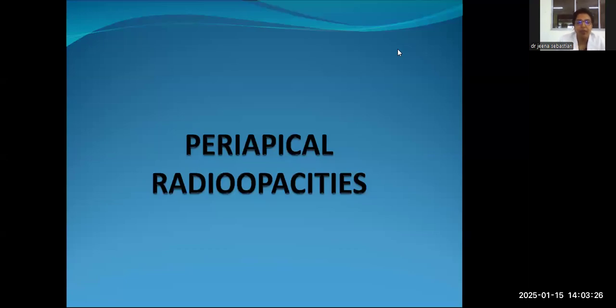Good afternoon, everyone. So, today's topic is periapical radiopacities. How do you classify periapical radiopacities? You have true radiopacities, anatomic radiopacities, and false periapical radiopacities.